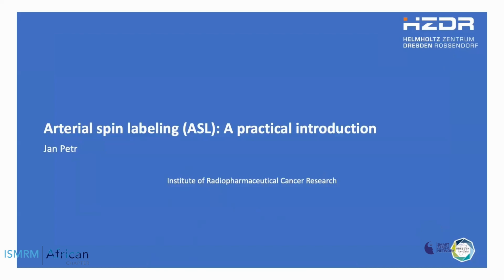And I would like to give you a practical introduction to arterial spin labeling, abbreviated as ASL, which is an MRI technique for measuring perfusion. The aim of my presentation is twofold. First, I would like to give you a light introduction to ASL, explain the basics, the theory and applications. My second aim is to provide you a practical guide for starting using ExploreASL yourself. So I will provide you the most important tips and hints and references to the articles that will help you start using ASL in clinical research or clinical practice.